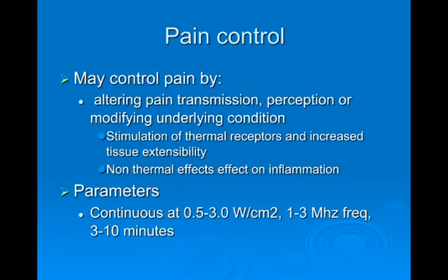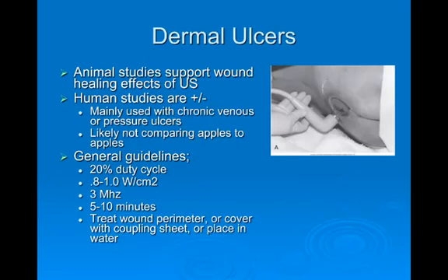Any kind of power setting, any kind of megahertz frequency, either 1 or 3, and a time frame in that 3 to 10 minute range. Okay, and again, not a whole lot of literature in support of this, and we're probably doing other things. We're probably affecting some of the inflammation, or increasing the tissue extensibility, causing pain control, rather than a true pain relieving function of the ultrasound.